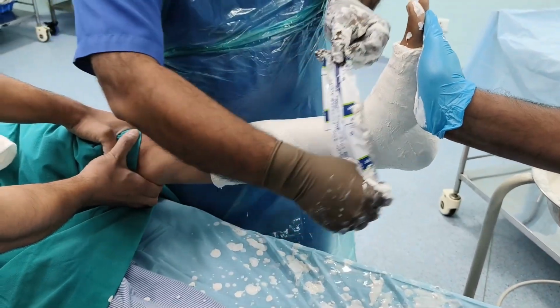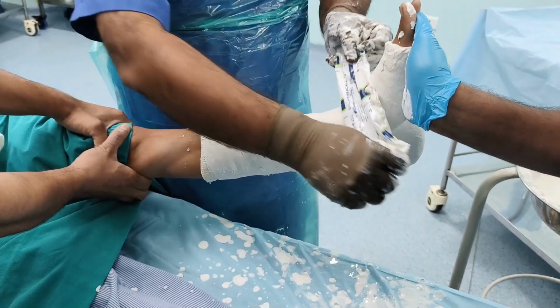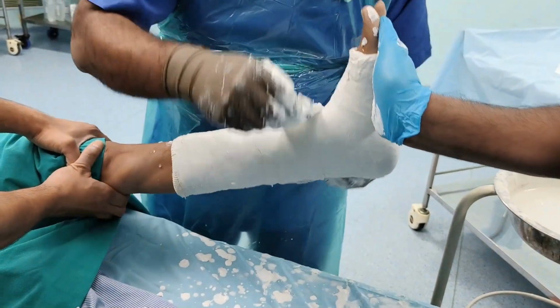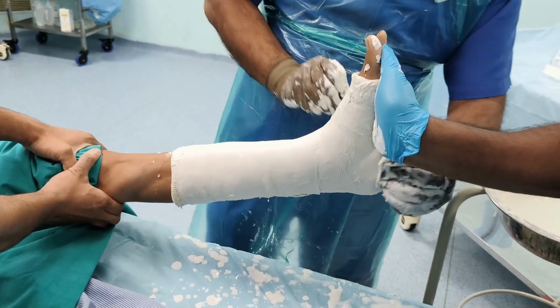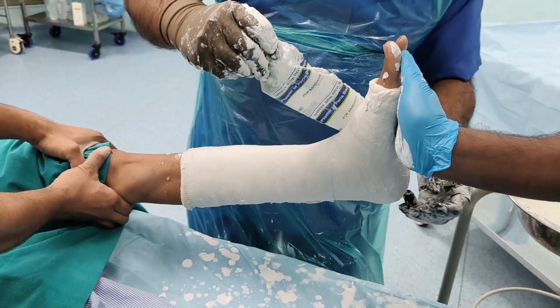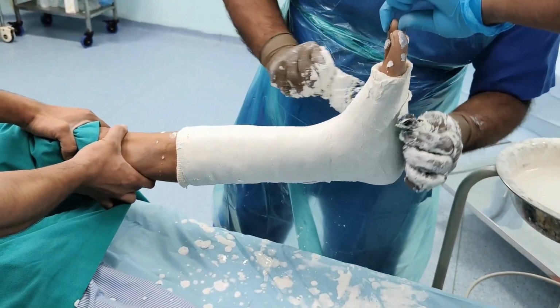This has no relation to the functional outcome. This is just for beautification. It looks good. When the patient feels good and it looks like that some person who knows about the plaster technique has applied the plaster. So always use this. It will give you a sense of satisfaction. Ramesh ji, can you remove your hand? Okay. And just smoothen it out.